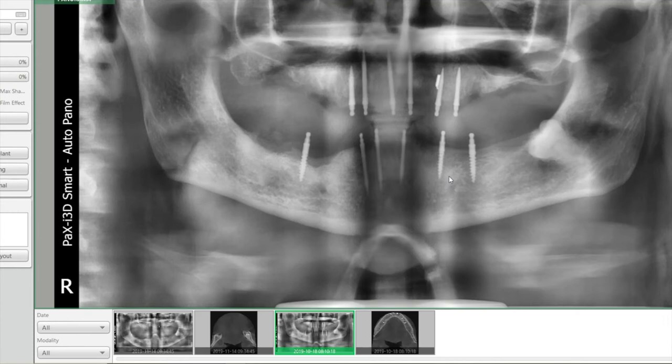And also, something went wrong surgically, and the patient had to be hospitalized in the emergency room for a few days, he said. So he came to me, and one of his main complaints was that he had this denture and he couldn't even get it on. He just couldn't get it on. One of the issues that I was seeing with this is obviously, there's a laundry list of things that I see wrong with this, but one of the other things is the angulation of these temporary implants. Angulation of the implants is very important when we're talking about dental implants.